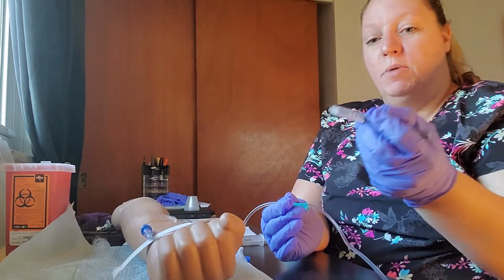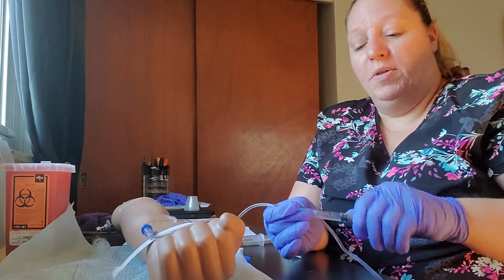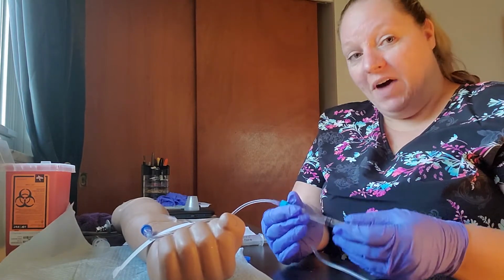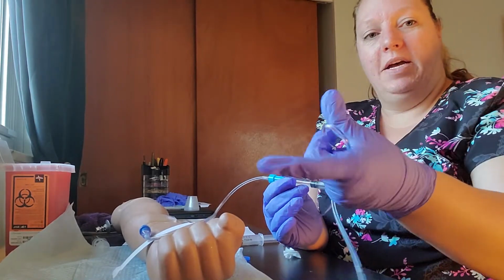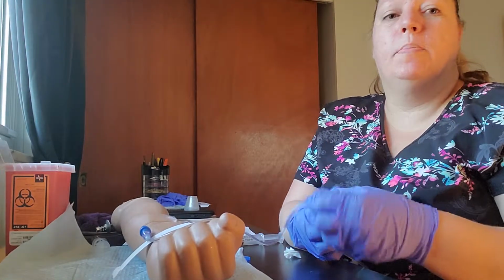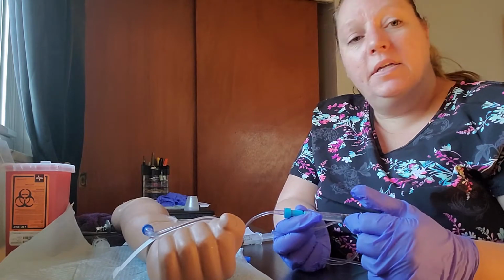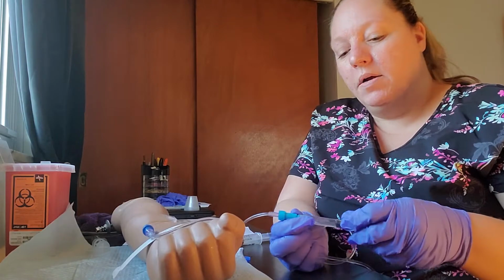Get our medication, our bumetanide, which should have a label with the medication on it and today's date. It's that 2 milliliter bumetanide. Remember that's 0.5 because 0.25 is 1 milliliter. So I'm going to clamp my IV tubing and I'm going to start pushing this. I need to make sure that I aspirate first to make sure that I don't have any blood. No blood coming back. If I did, then I would want to push it just a little slower than the 60 seconds that's required. So I'm going to start pushing.